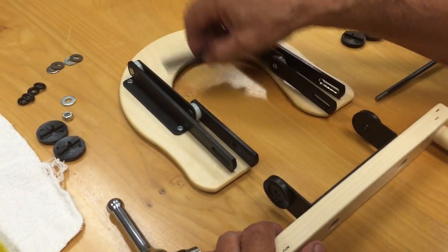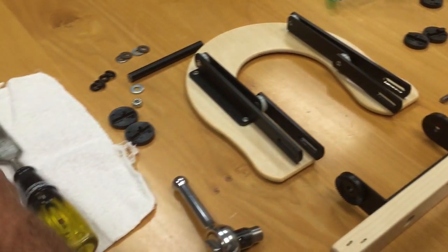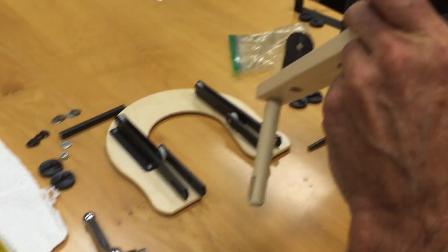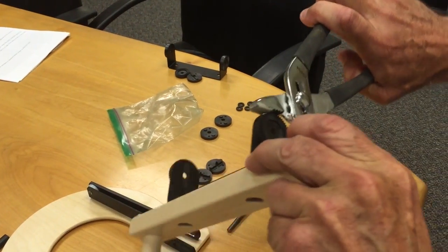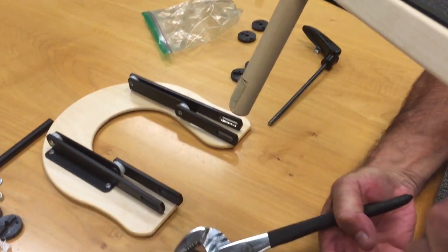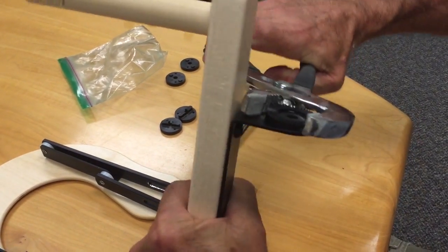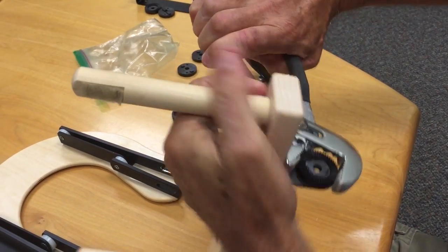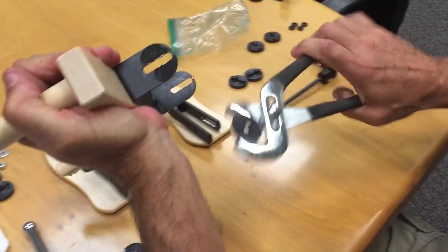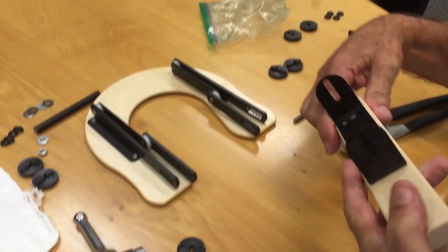Now, once we've disassembled to this point, we need to remove these discs, which can be done by grabbing them with a locking pliers, twisting gently, and it will break loose. They have been super glued, but they will come apart. It may take some force, but it will come off.